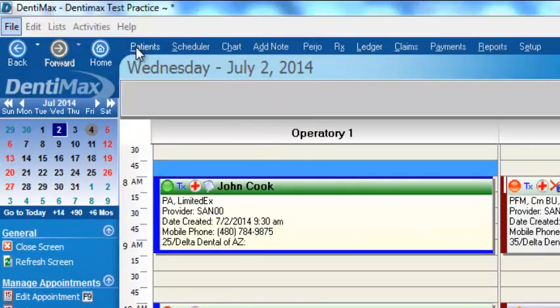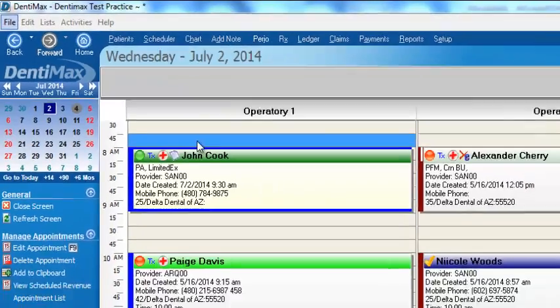At the top of your screen, you'll always have a dark blue toolbar which includes the perio measurements. So no matter where you're at in the program, you can get to the perio area by clicking on perio at the top of the screen.